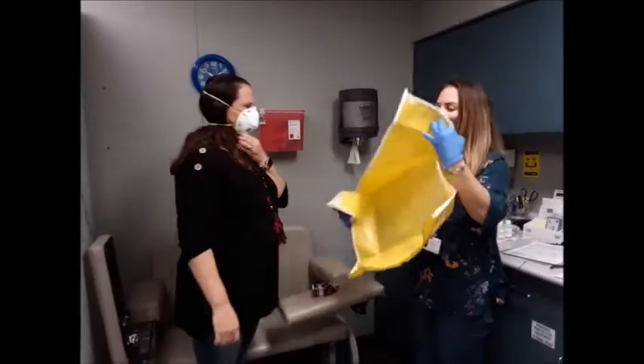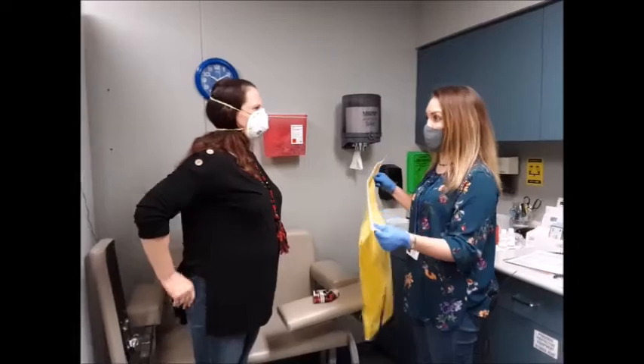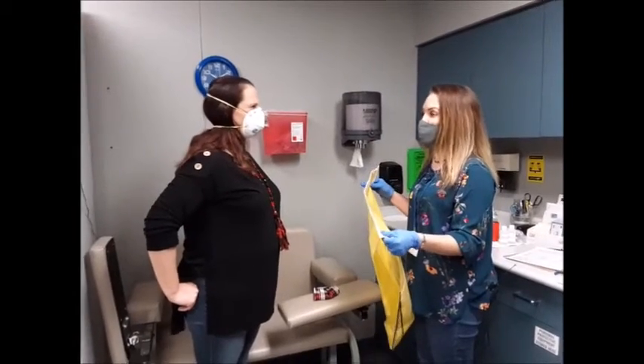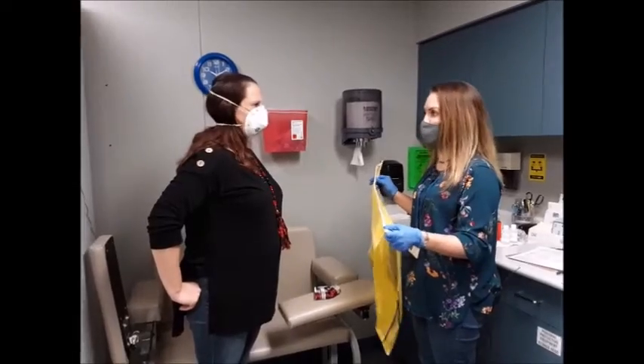So now I'm going to put this back on and I'm going to spray that solution again. I need you to tell me if you smell or taste anything bitter or sweet. The point of this test is to make sure that you cannot smell it — so if you don't smell it, that's good. That means the mask fits.